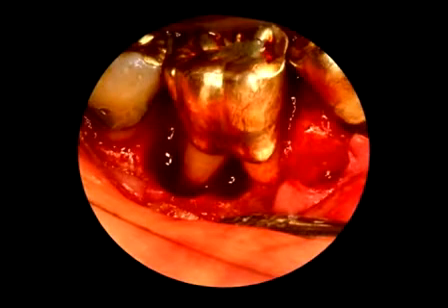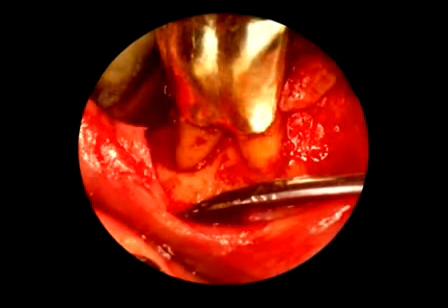As a teaching case, to demonstrate that surplus after filling is irrelevant to the outcome, a buccal flap was reflected, and we can see a massive furcal blowout and a distal infrabony pocket. 2 years later, the patient was reappointed for recall.